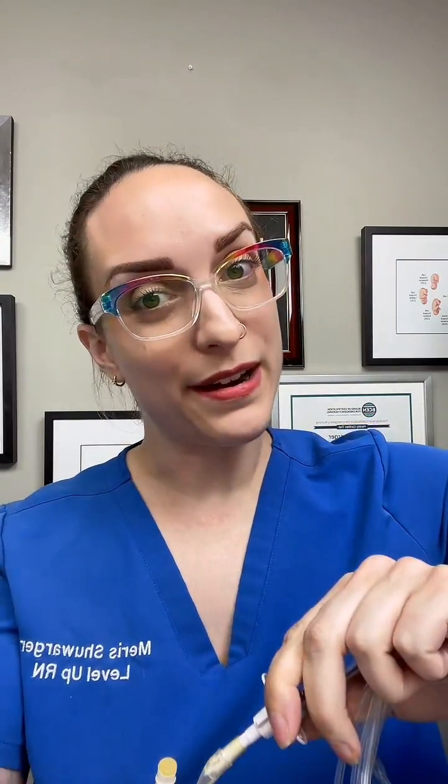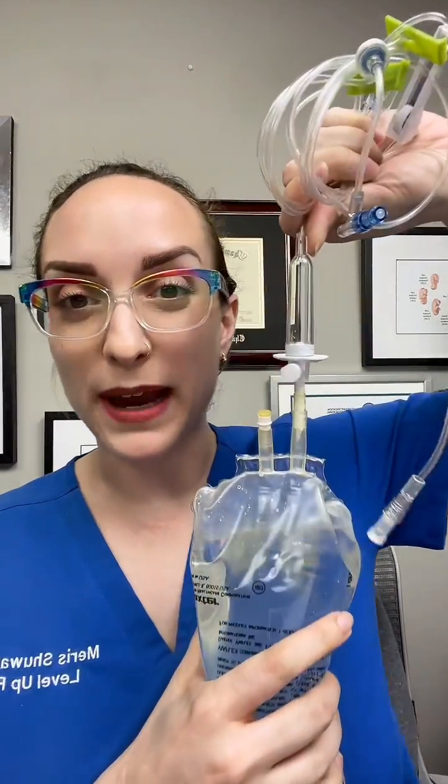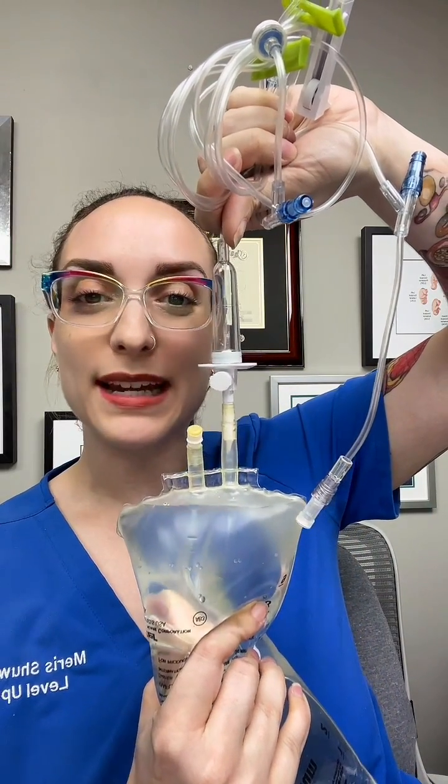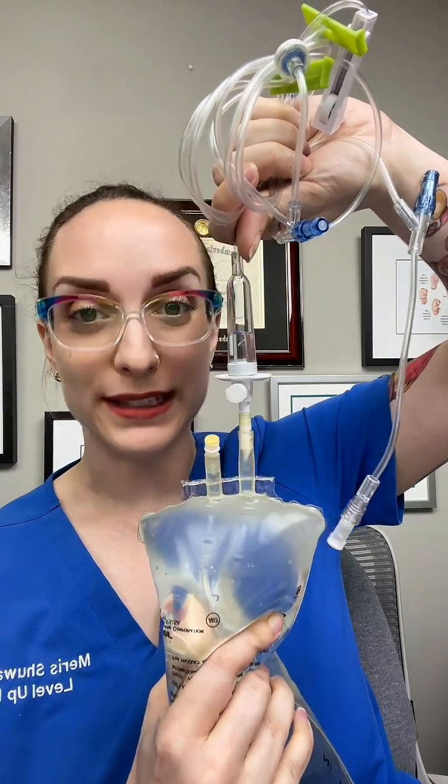I'm not in a hospital or else I would be wearing gloves to provide this kind of care, but you're going to uncap both of these and then go ahead and spike your line. Once you have fully spiked the bag, leaving it open to gravity, you're going to squeeze and get the air coming out. Squeeze until your drip chamber is half full, then stop.